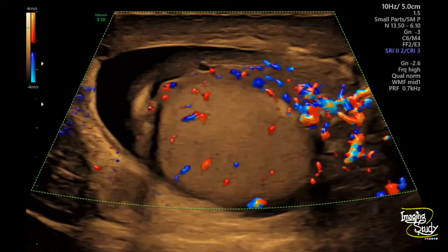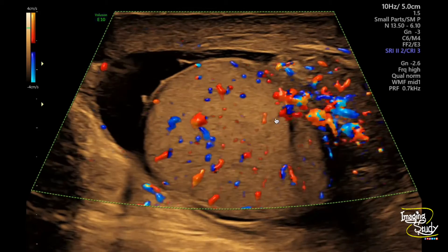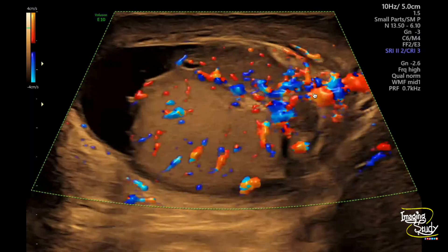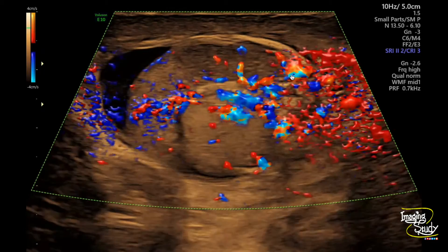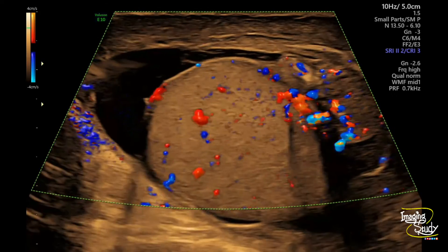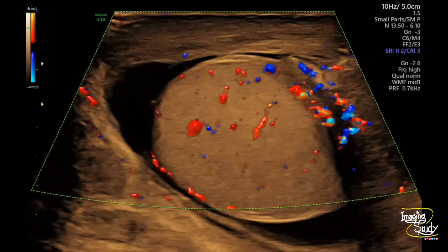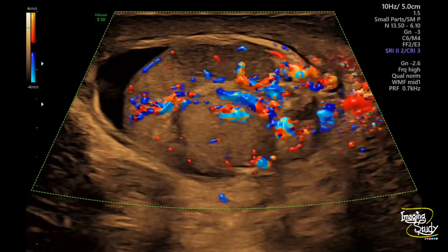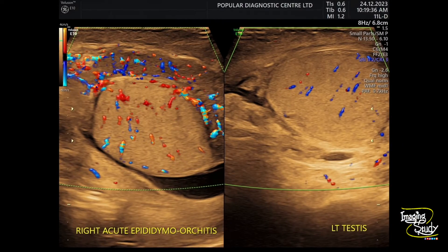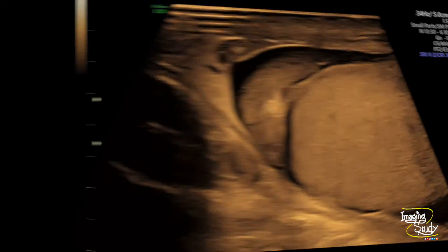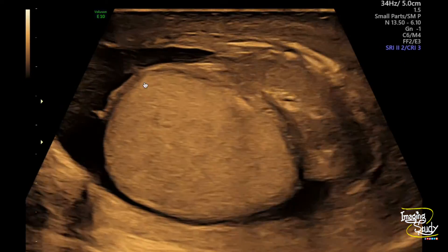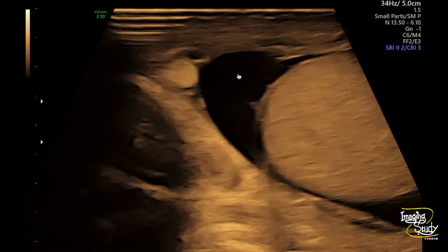Now with similar settings, this is the right testis. You can see prominent vessels within the testis and epididymis. The epididymis is more affected because the vascularity there is more prominent. If it were a case of torsion, there may not be any vascularity. You can compare the normal left testis with the abnormal right one — there is clearly increased vascularity on the same settings. The epididymis is more affected, and you can see surrounding hydrocele.